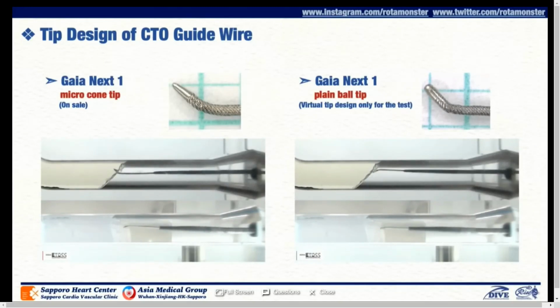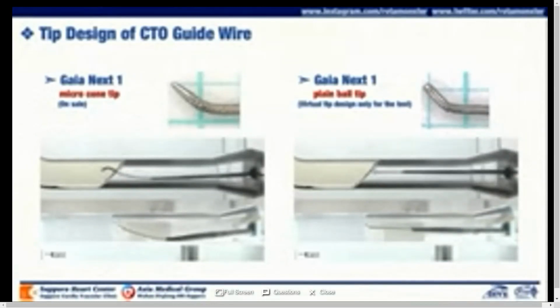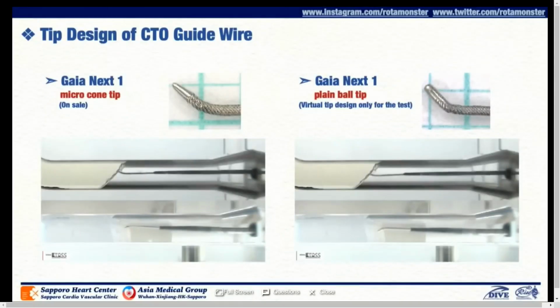The normal Gaia Next 1 on the left makes the penetration of the cap by deflection. On the other hand, the Gaia Next 1 on the right, with only the wire tip as a ball tip, does not penetrate the cap, but rather slips on the surface of the cap.